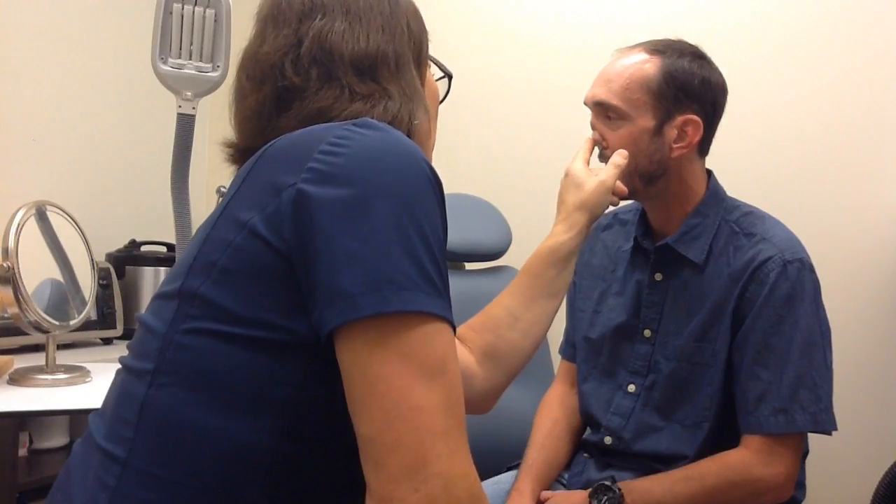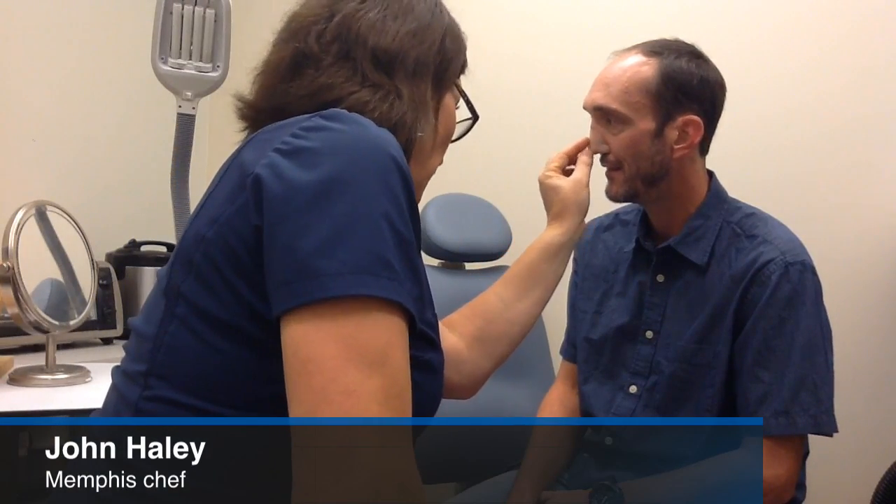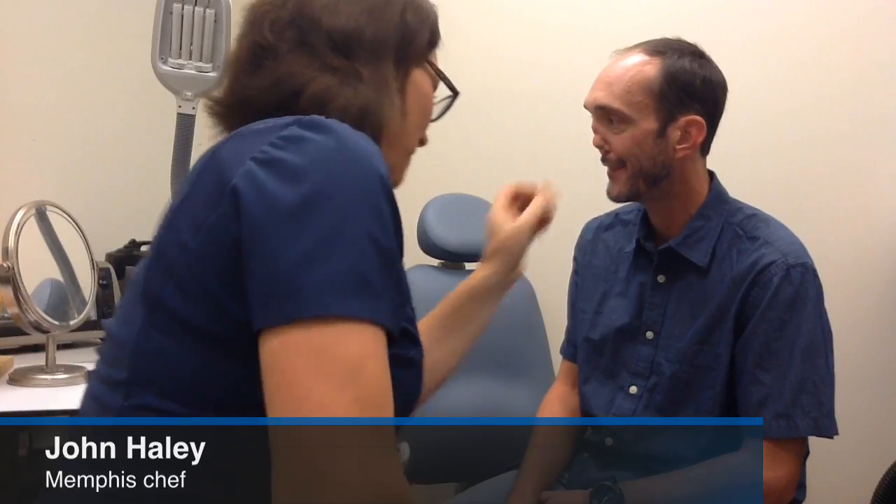Really, this is for you. So you see this little part right here? This little one first? You see that piece right there? Yep. Real easy, right? And then this will go on here. Pretty cool, right? Yep.